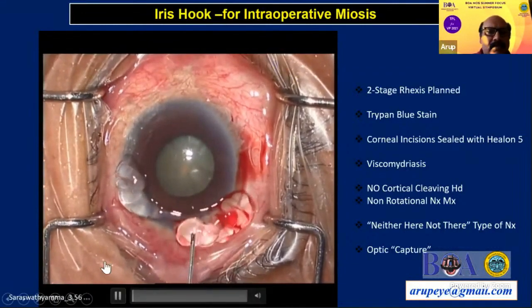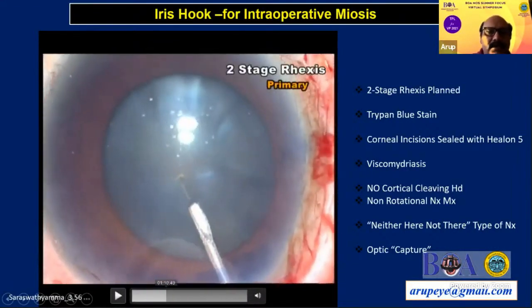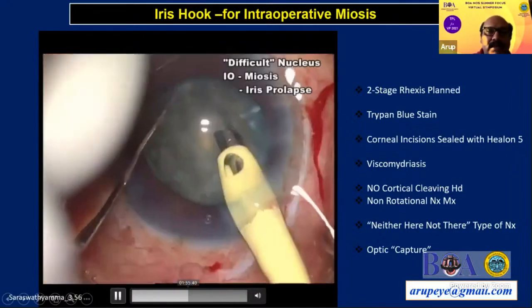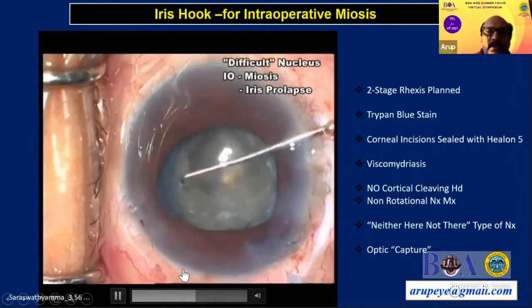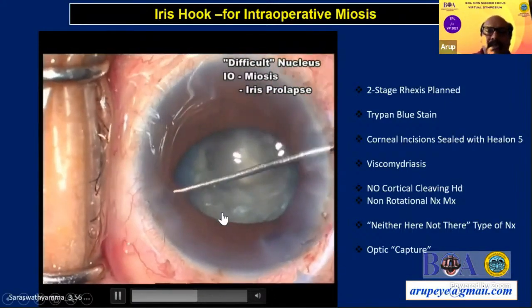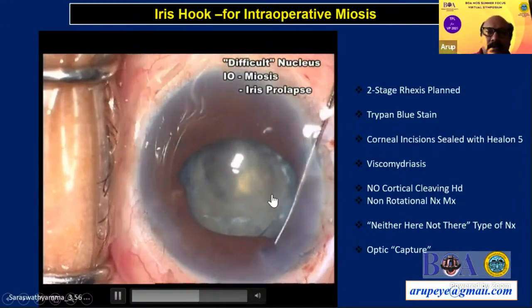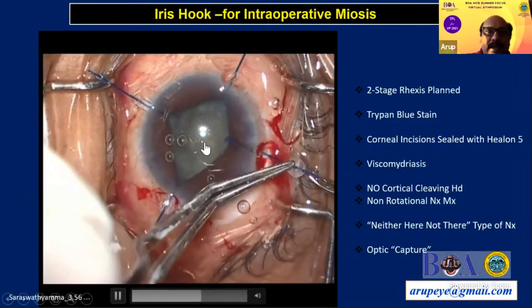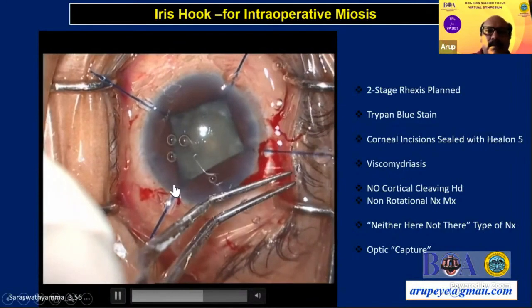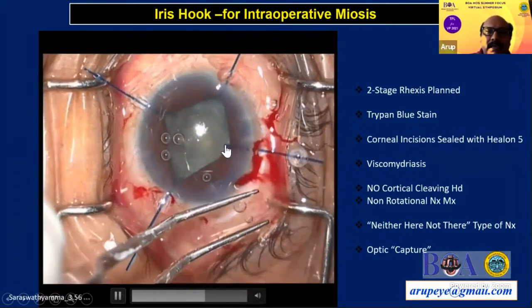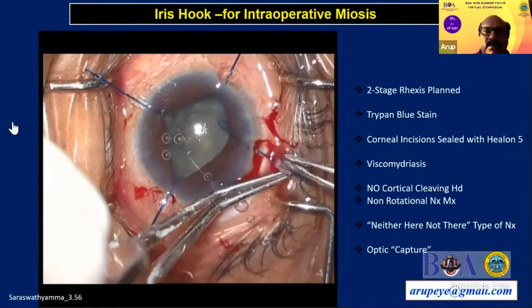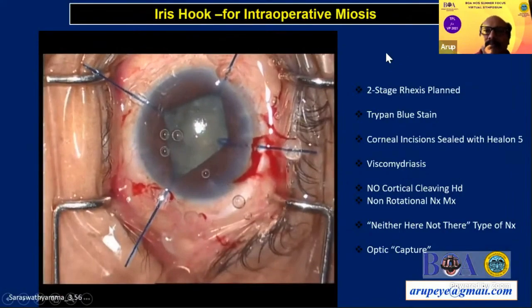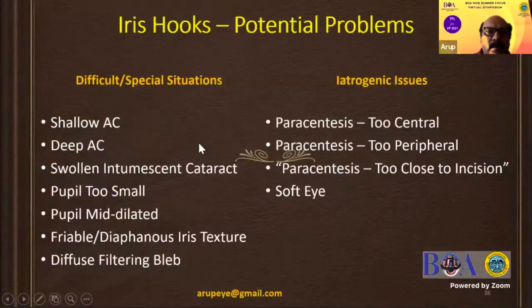Let us see this video. This was an intumescent cataract with a very shallow anterior chamber. Surgery started well — with viscoelastic the pupil dilated extremely well — but the patient developed IFIS intraoperatively. You can see the pupil becoming small and surgery becoming difficult, so I decided to use an iris hook intraoperatively. One important precaution: when applying the iris hook — and this also holds for any ring device — ensure the hook does not engage the capsulorrhexis margin. In this case the rhexis extended to the periphery, so inject OVD between the iris and anterior capsule, create a safe zone, and ensure the iris hook only engages the pupillary margin and not the rhexis margin.